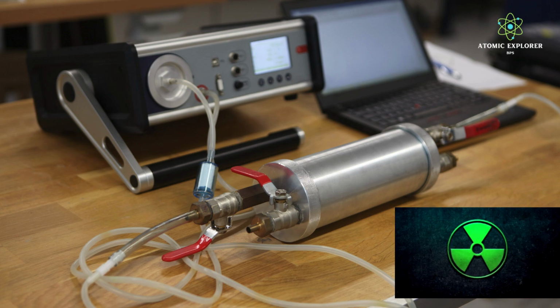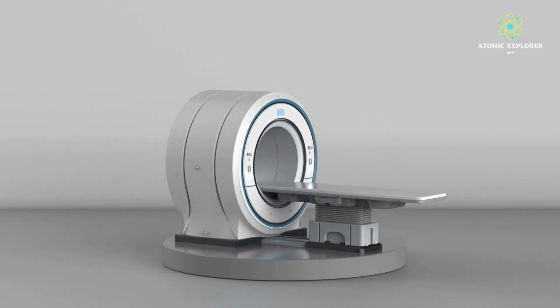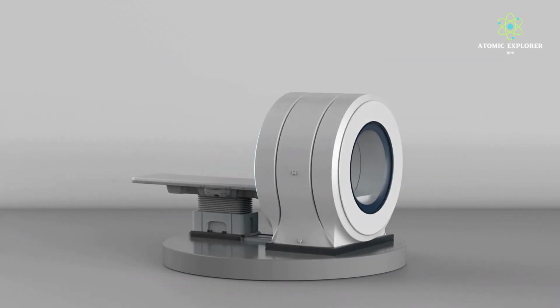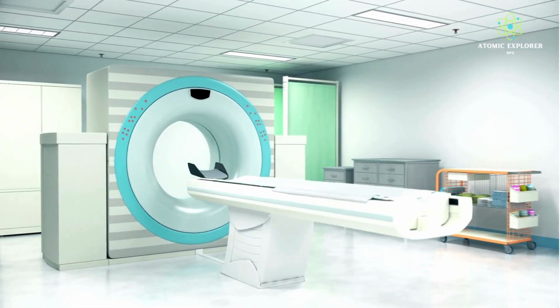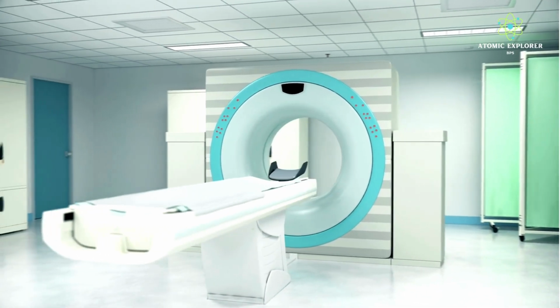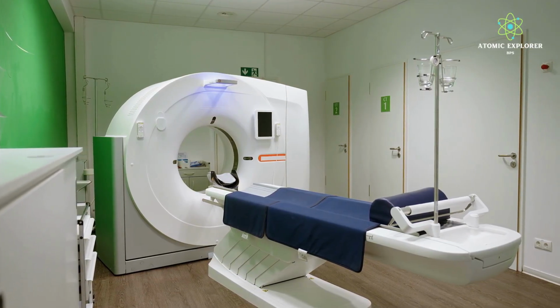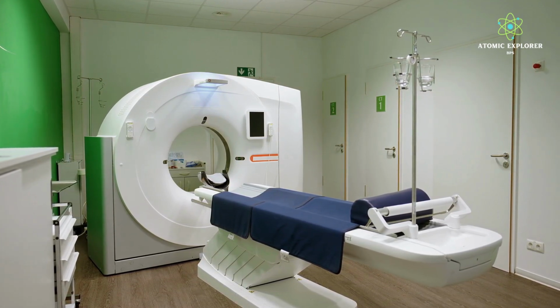In a typical PET machine, there are around 600 to 700 BGO detectors, and these detectors are arranged in the form of rings or panels around the patient, allowing for the detection of gamma rays emitted during positron annihilation events within the body. The exact number of the detectors can vary depending on the specific PET scanner model and manufacturer, but this range gives a general idea of the detector configuration commonly used in PET imaging systems.